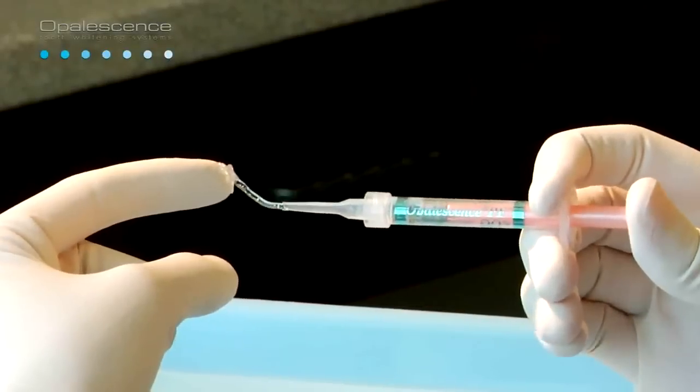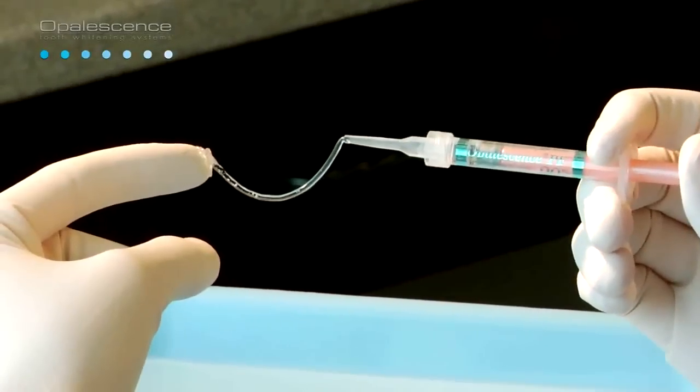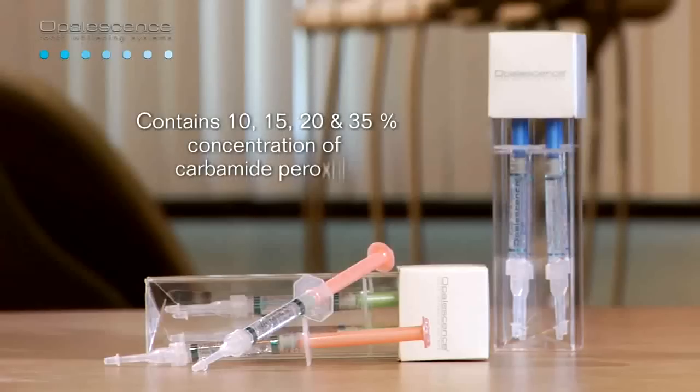Opalescence is dispensed in syringes and is a clear, flavored in mint, melon, and regular, sticky, viscous gel. It is available in 10, 15, 20, or 35% concentration of carbamide peroxide.